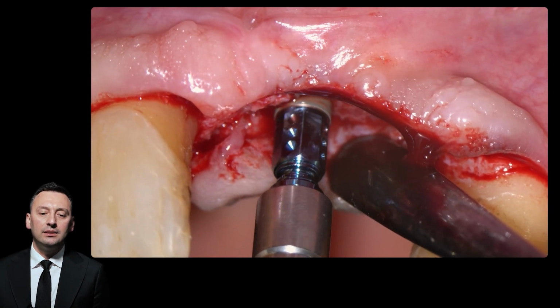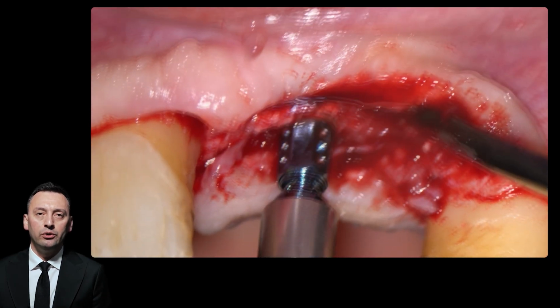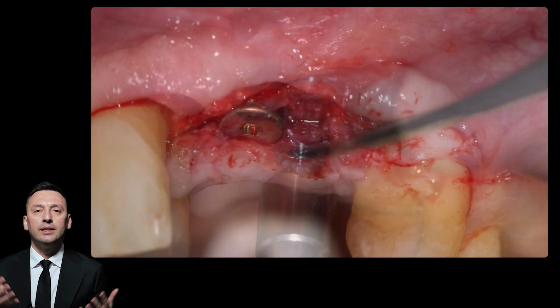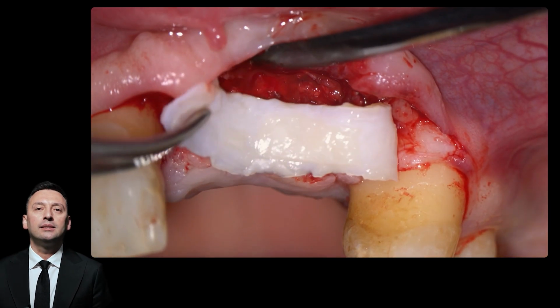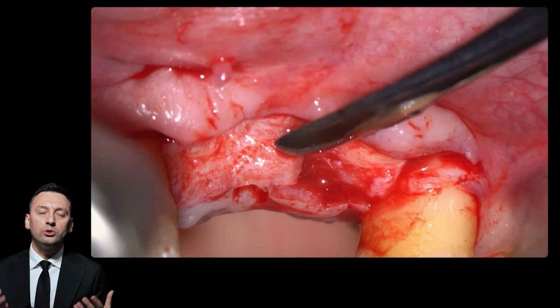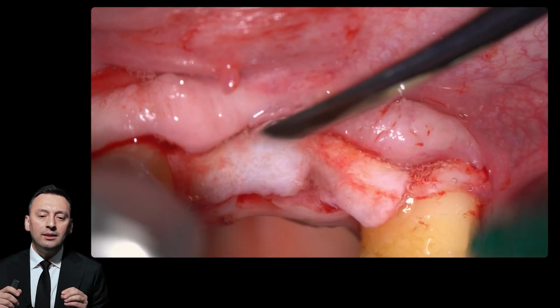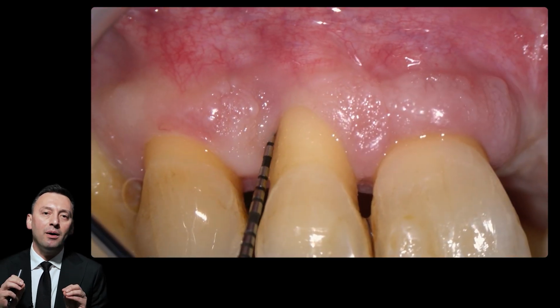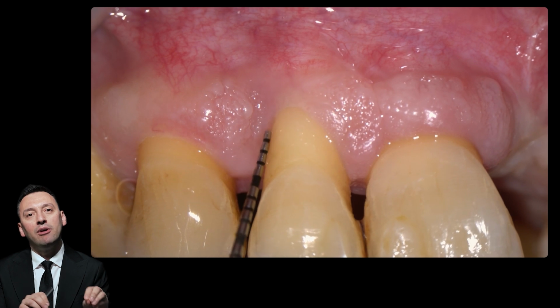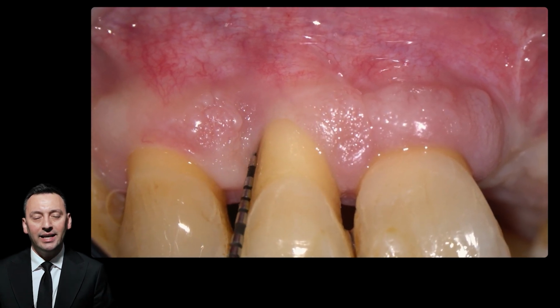I'm going to place the implant, of course, with respect to the manufacturer's recommendation, getting primary stability. And we should not forget to improve the soft tissue conditions by adding a connective tissue graft. But to me, the most important and critical part is to achieve pocket closure for this particularly challenging case.